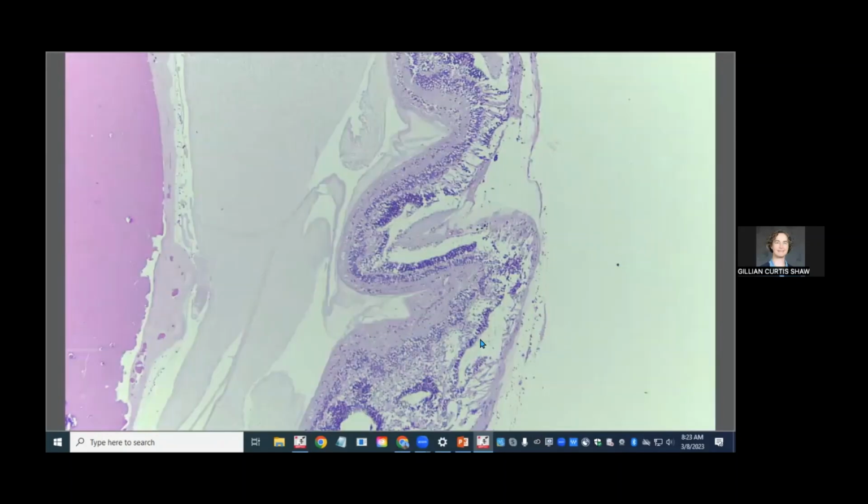It's a little bit disorganized. You can see that the outer nuclear layer, which is the photoreceptor nuclei, is intermittently present. There are also some big wide spaces in it. That's retinoschisis, which often develops secondarily to retinal detachment, prolonged retinal detachment. It can also be a congenital lesion.